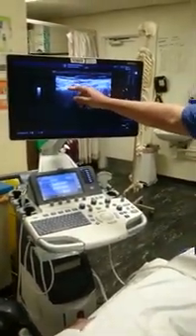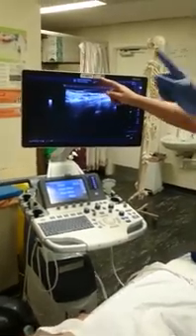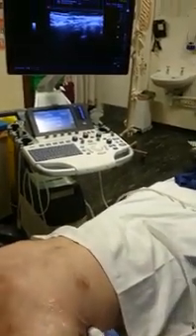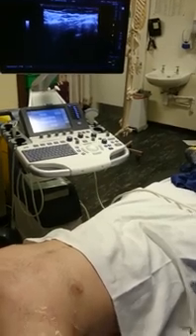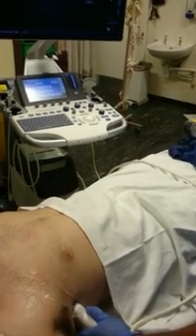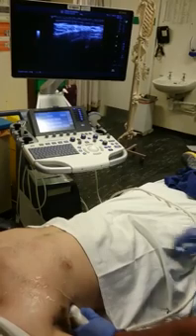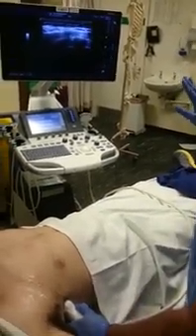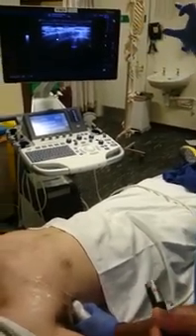The thoracodorsal artery — obviously the dorsal side is upright. Thoracodorsal is in the thoracic region — that's how I remembered it. It's in the thoracic region and it's close to the lat dorsi muscle, that's why it's called thoracodorsal. This is your ideal picture for your serratus anterior block.